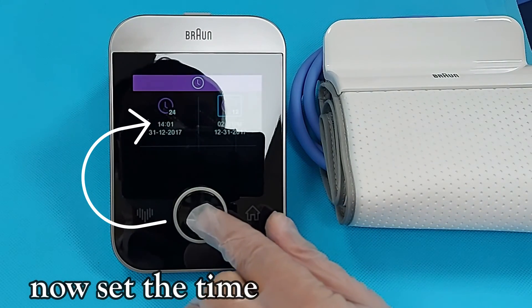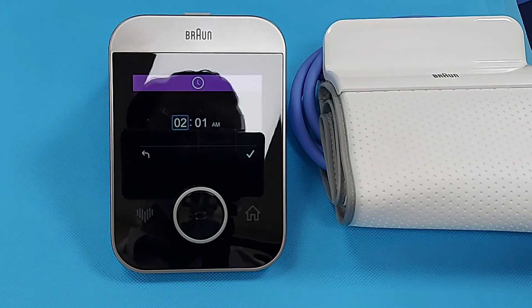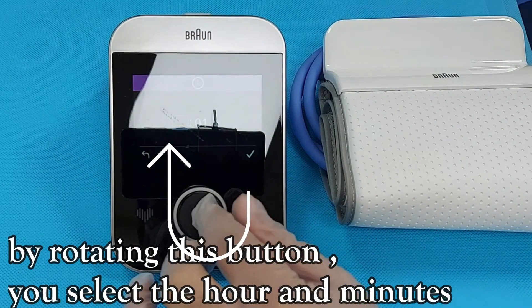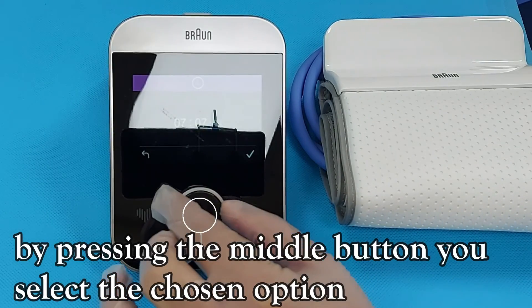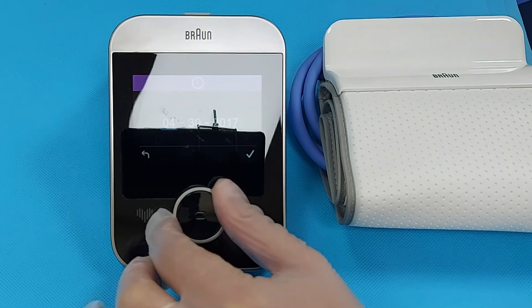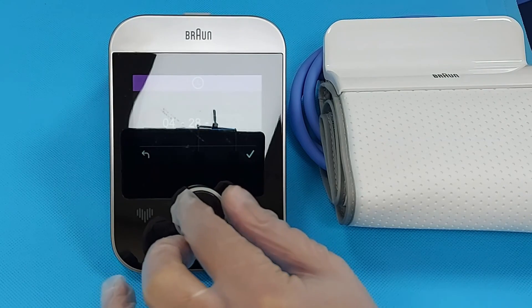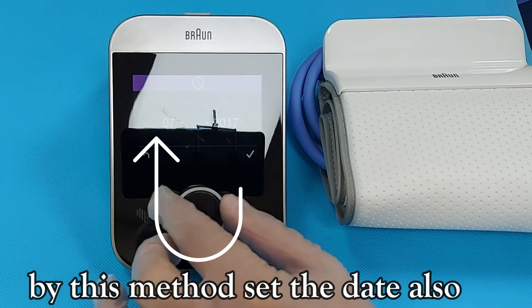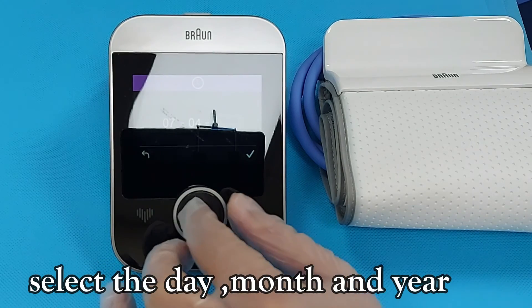Now set the time. By rotating this button you select the hour and minutes. By pressing the middle button you select the chosen option. By this method set the date also — select the day, month, and year.